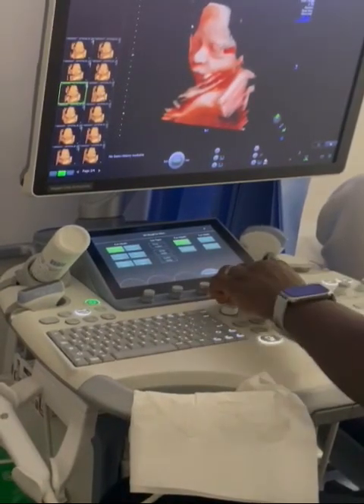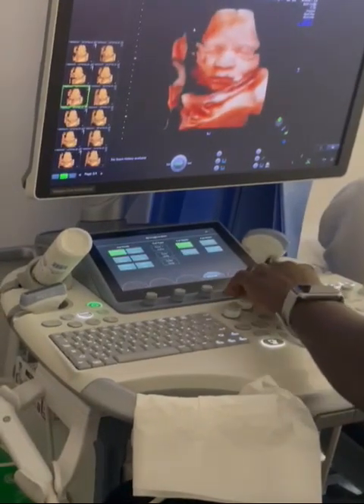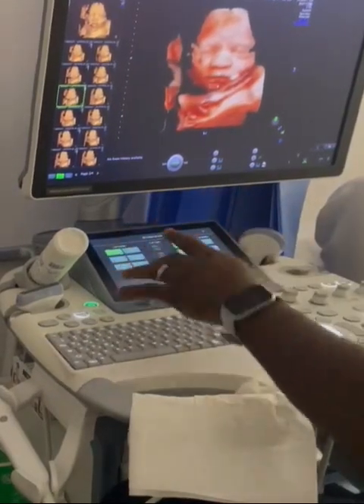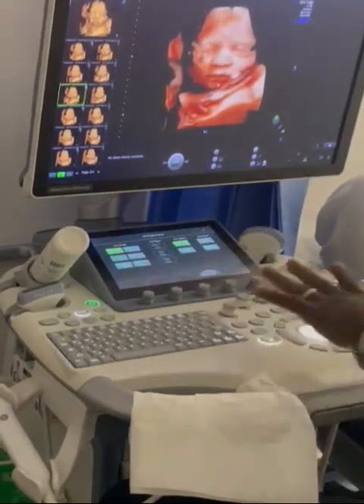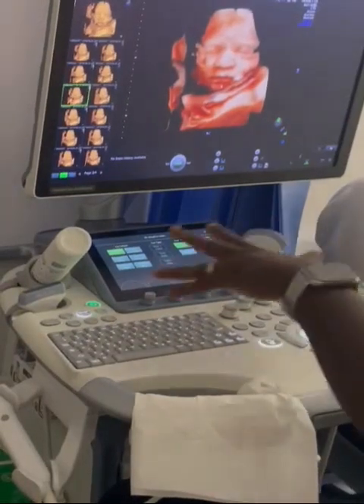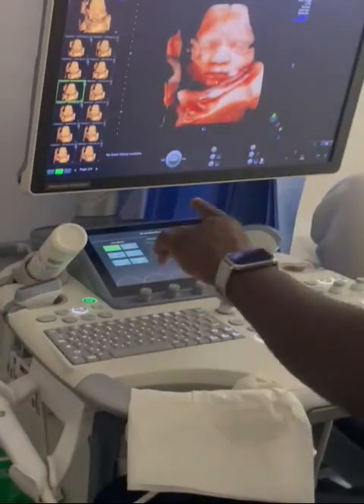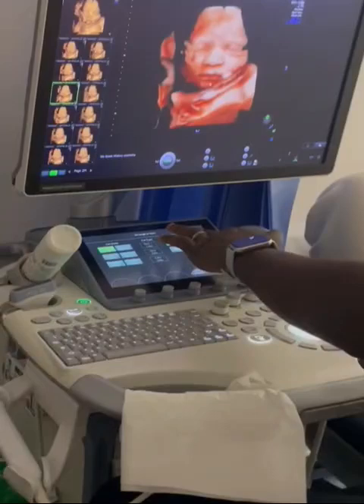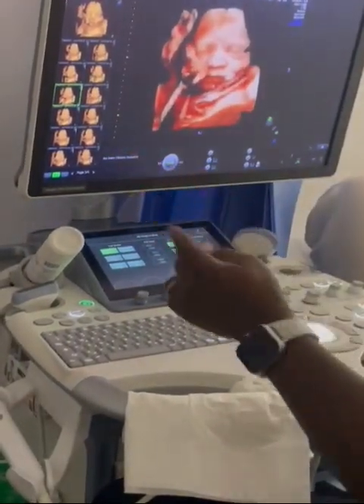Update, then return my baby. You see, we've taken that out again. Save this, and I can do all of that. So depending on what you can box inside, box outside, depending on the machine you are using, I think S8, S10, S20, they all have almost similar things on the keys. So let me undo all of that. You can see that undo all brings everything back to the face of the baby.